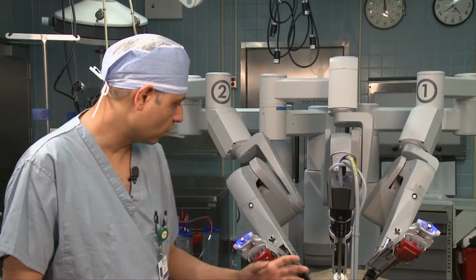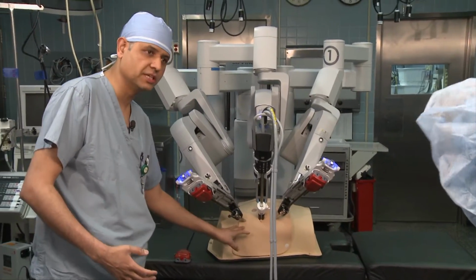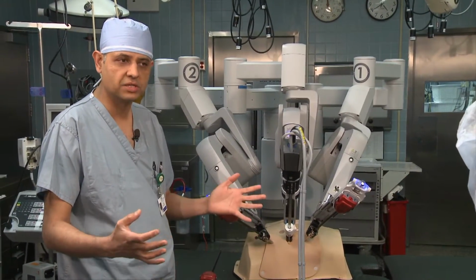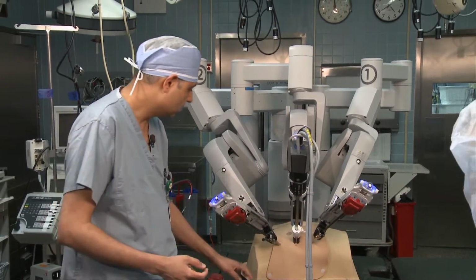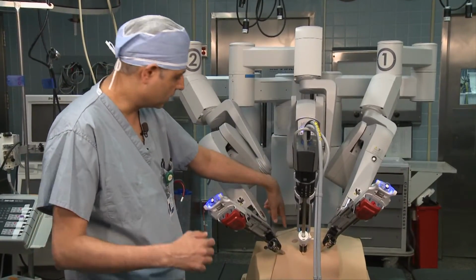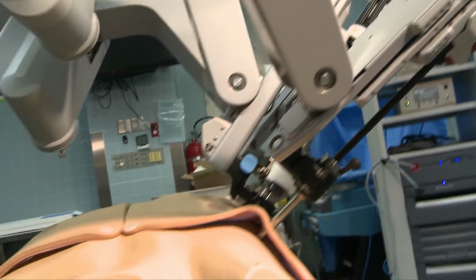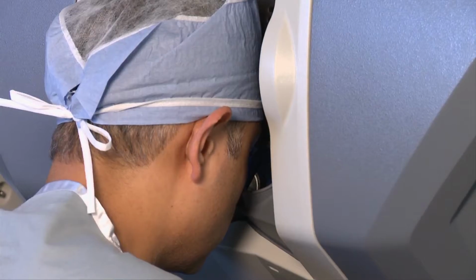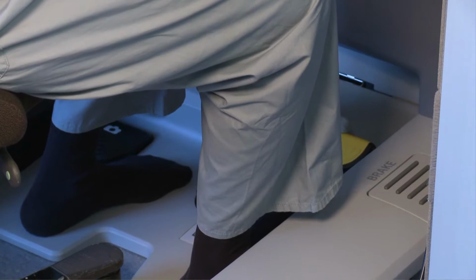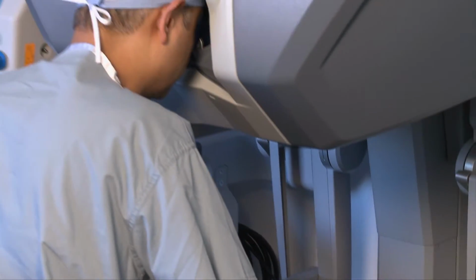As you can see over here, these are the 3 holes we have made in this mannequin to put the instruments. If the operation is not going right, or we think that this patient is not suitable for robotic, we just take these instruments out, roll the cart away, I scrub in and make an incision in a standard way. Robotic surgery is not automatic surgery, however. The doctor is in personal control at all times. Seated at a panel with foot and wrist controls, he directs the robot's every move.